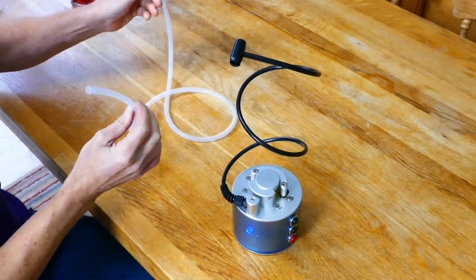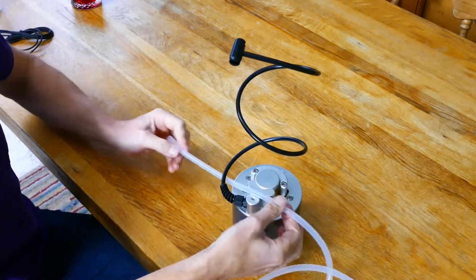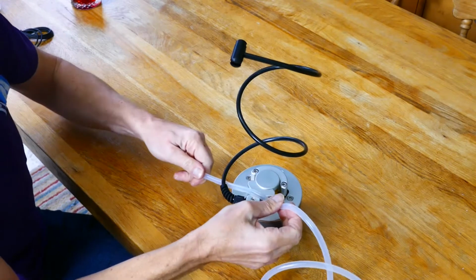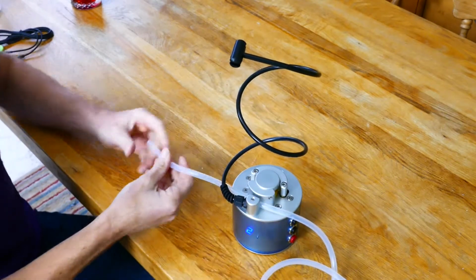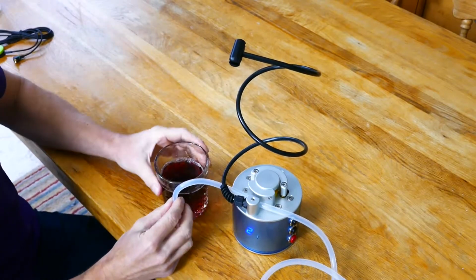Next thing I'm going to do is fit the straw, starting off by feeding the straw through this gap here. This is called the peg. I'm just going to pull the straw into the gap, leaving enough straw on this side to go into the cup. As you'll see here, I'll put it in that in a minute.